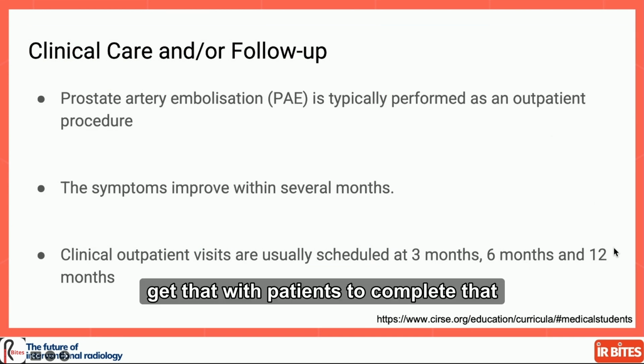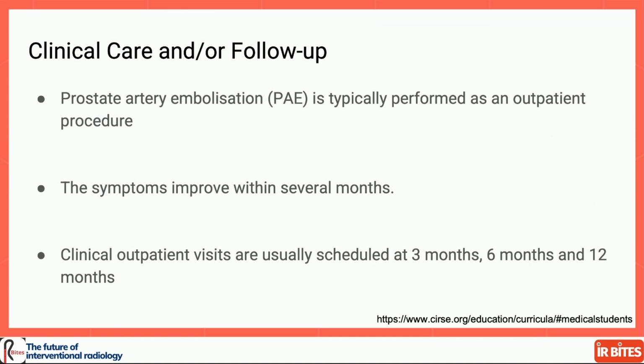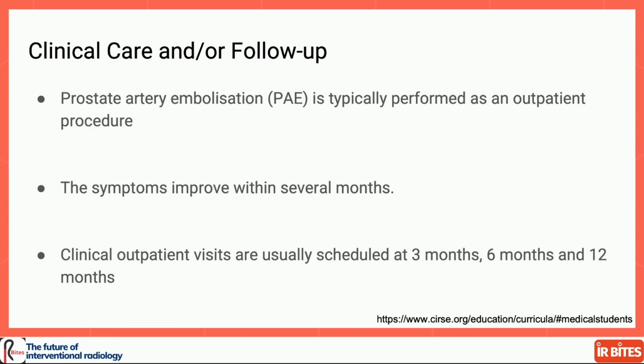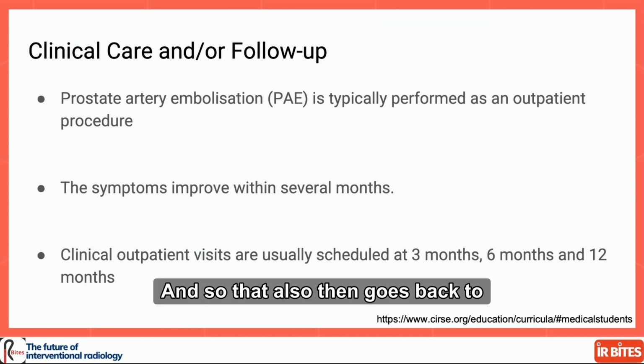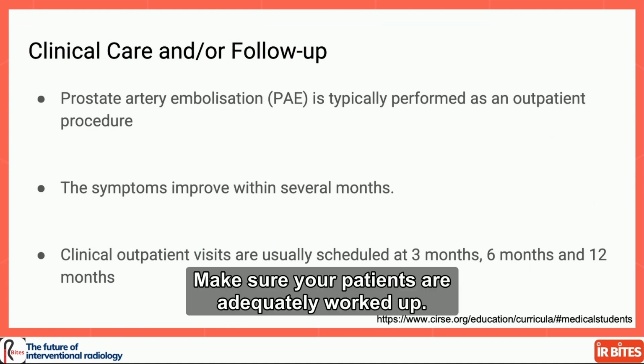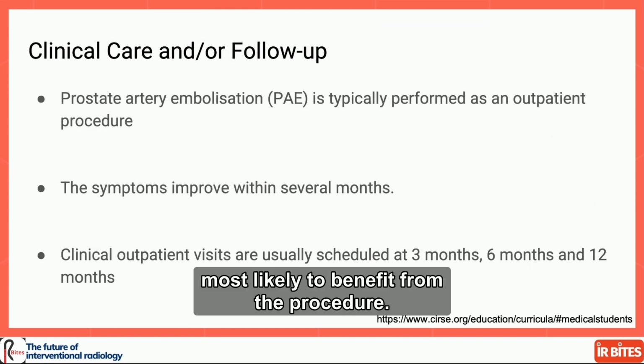Get that with patients to complete that in order to see if your procedure has worked. And so clinical follow-up is important, and particularly of symptoms. And so that also then goes back to, in terms of patient selection, make sure your patients are adequately worked up. You've selected the patients who are most likely to benefit from the procedure.